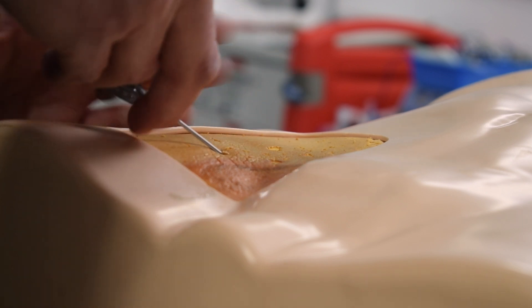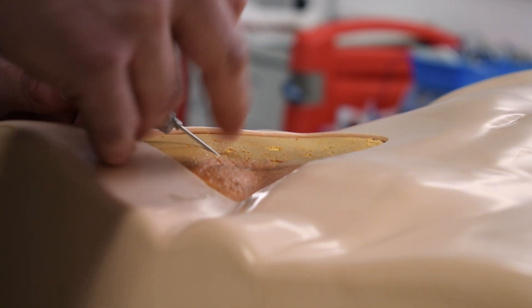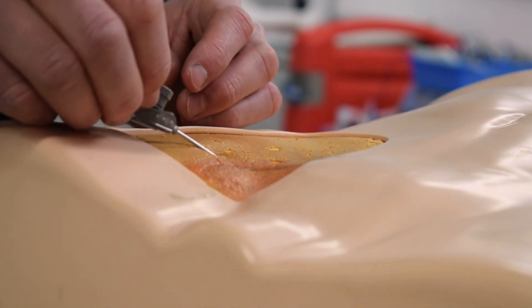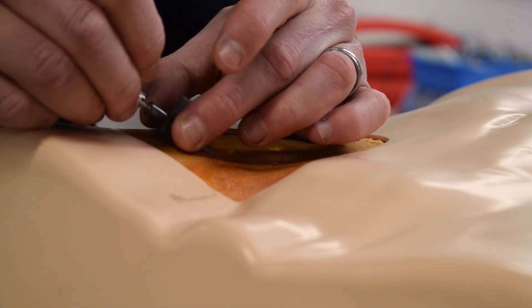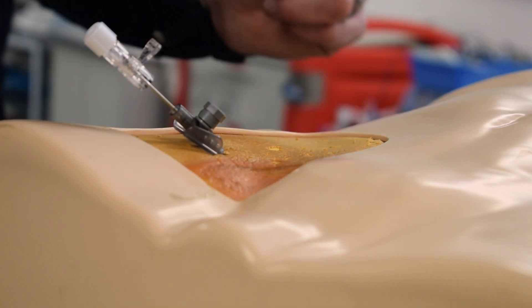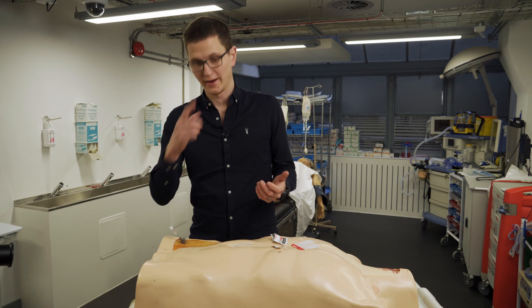We're going to push down, and then you should get your flashback. Once you have your flashback, you advance it a millimeter and you push in. And there we go — that is your femoral vein cannulation.